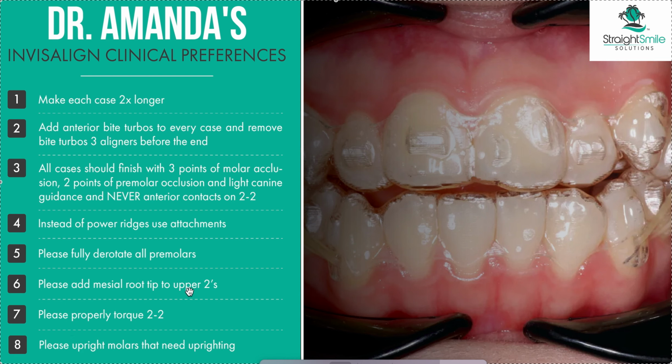And number 8, so often they do not properly upright molars, especially if they're tipped. So you have to specifically ask them to upright the molars. If you don't ask for it, they're not going to do it, okay? So if needed, I'm going to ask for them to upright it. I'm going to say, please look at the panel. Upright the teeth. I want all my molars parallel.